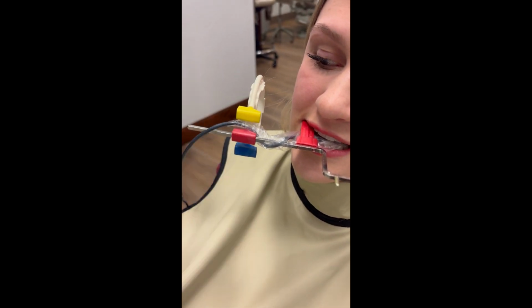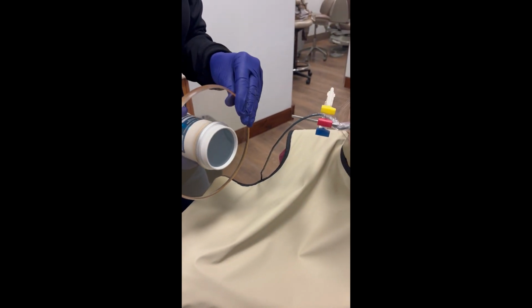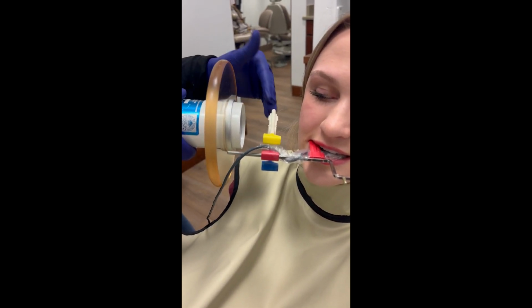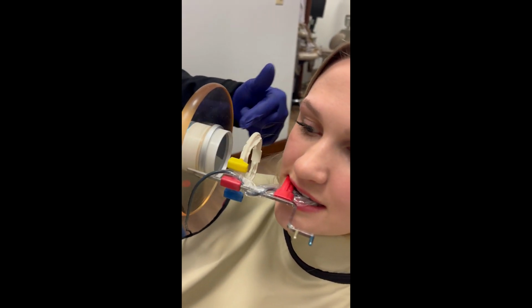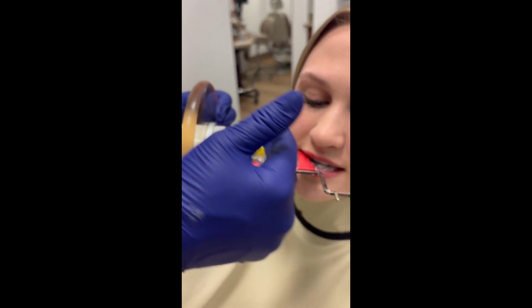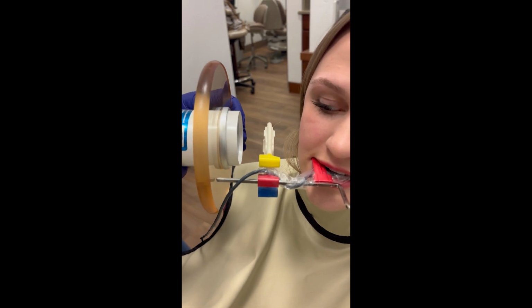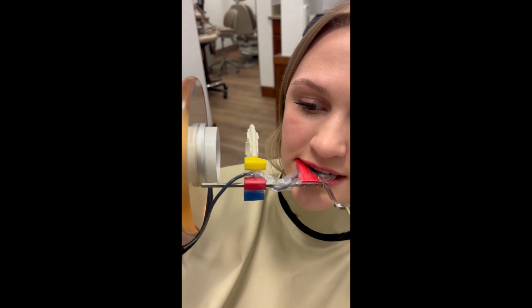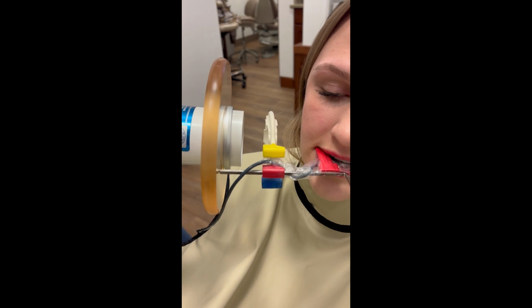If you imagine a central ray coming out of this x-ray cone, I'm actually trying to line it up, not necessarily with the ring. I'm thinking about this coming in perpendicular to the sensor, and I'm having the sensor and her teeth be parallel. This is called the paralleling technique. That'll allow me to open those contacts and capture the image the way that I would like. Here we go.